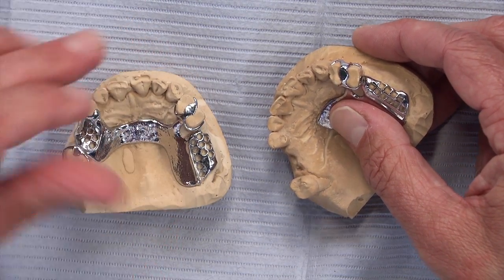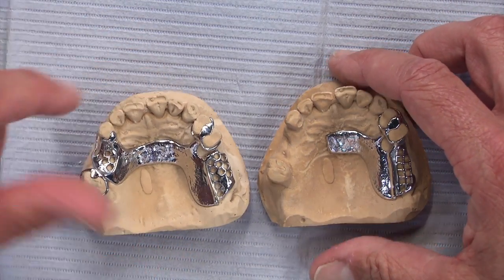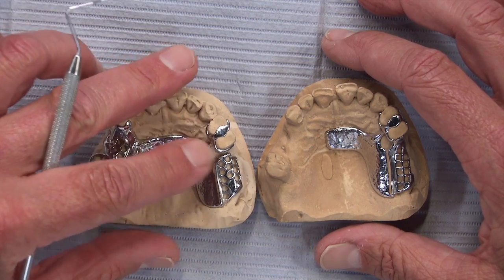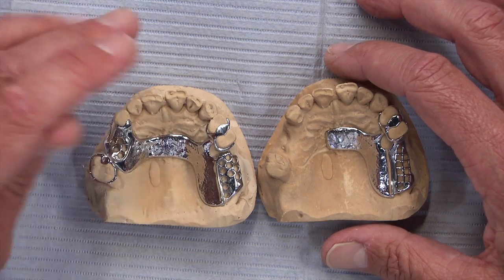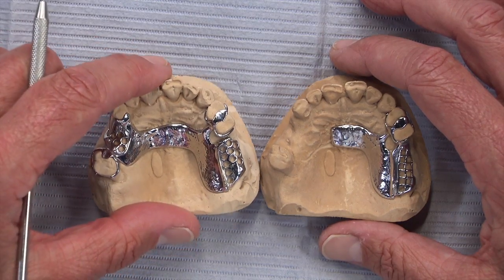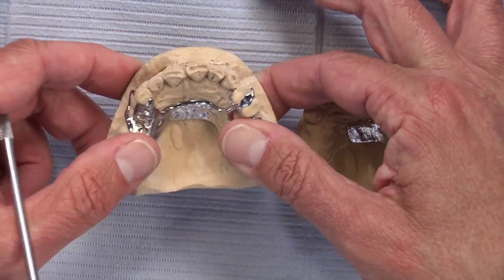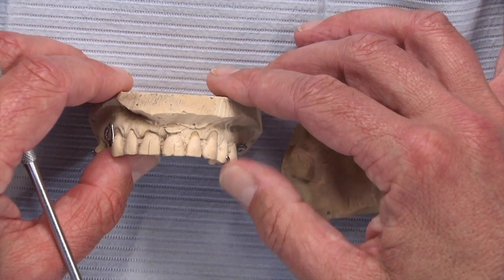Even though clasps by definition are metal and may appear unaesthetic, give the designers a chance. If you don't have an idea in mind, ask them to create the most aesthetic way to use metal in the case. You may need to bring the patient back one more time to create undercut on some teeth or remove undercut on others. As long as you're willing to do that and work with the designers, very often we can give you a design that you and the patient will be happy with — instead of seeing a bunch of metal, the patient may not see any at all, or just a very small amount.